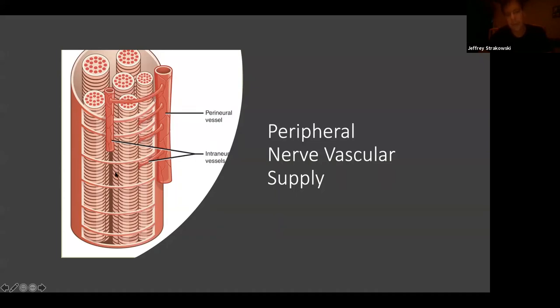We have to be careful too that we're actually not seeing pulsations from just perivascular structures that are there normally. An example of that could be a persistent median artery for the median nerve. And if you see blood flow there, I've seen people confuse that pulsation with neovascularization. So we have to make sure we've actually studied it and looked at it enough. And the other thing is make sure we don't have excessive gain and then we're just getting artifact.